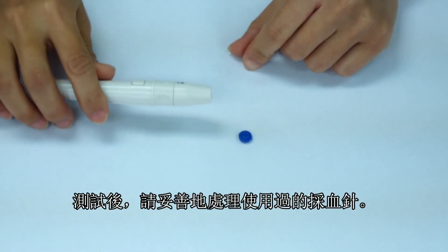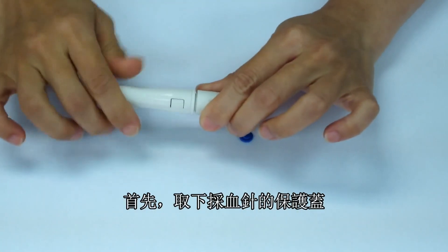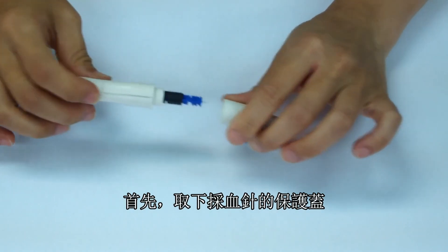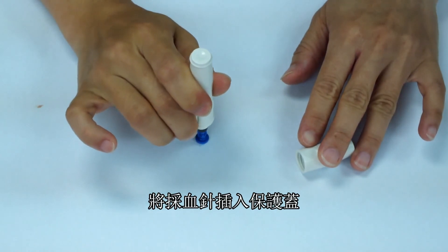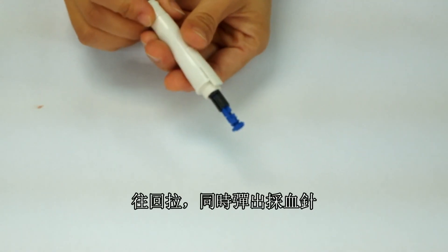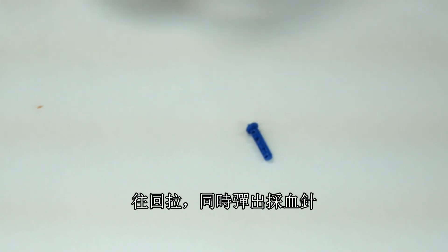Properly dispose of used lancets after testing. First remove the protective cap of the lancing device. Pierce the tip of the lancet into the protective cover, then pull back on the sliding mechanism and push forward on the lancet ejector simultaneously to eject the lancet.